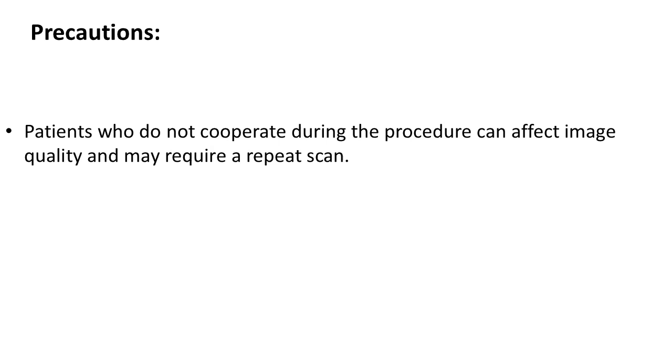Precautions: patients who do not cooperate during the procedure can affect image quality and may require a repeat scan.